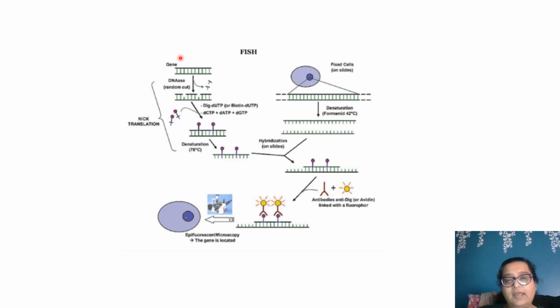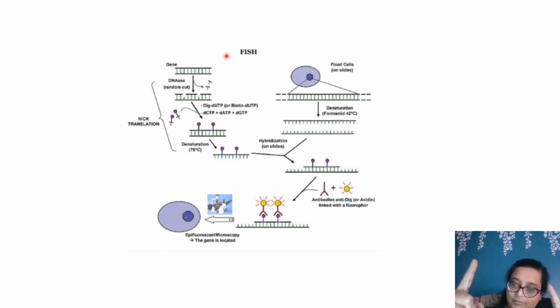To continue, before I show you this image: you have to attach a synthetically manufactured DNA probe to the DNA of a diseased human patient. It is quite logical and understandable that this will only happen when we know which defect we want to study.